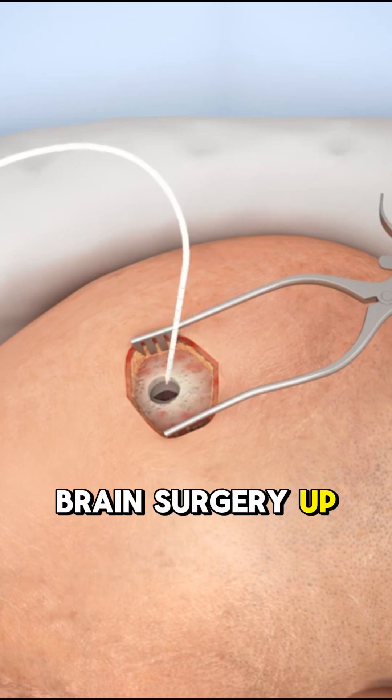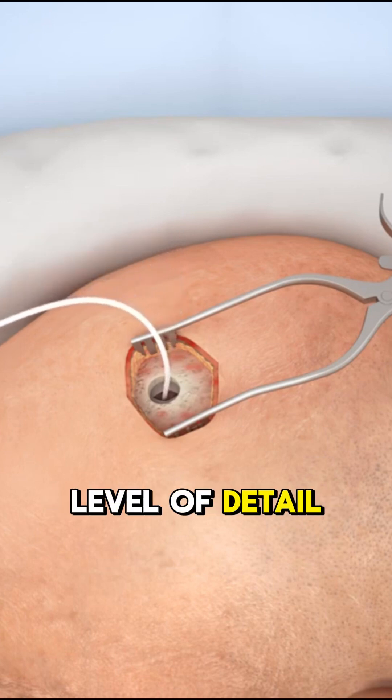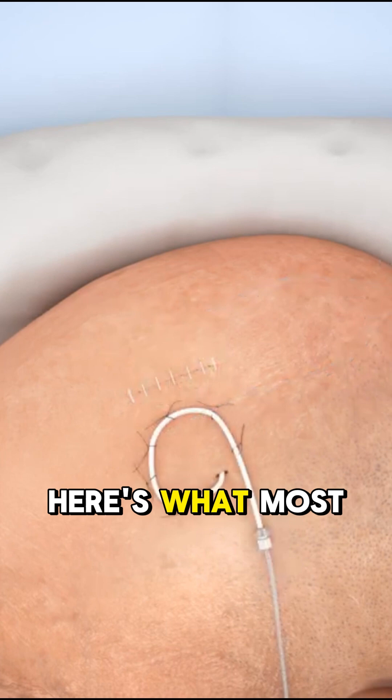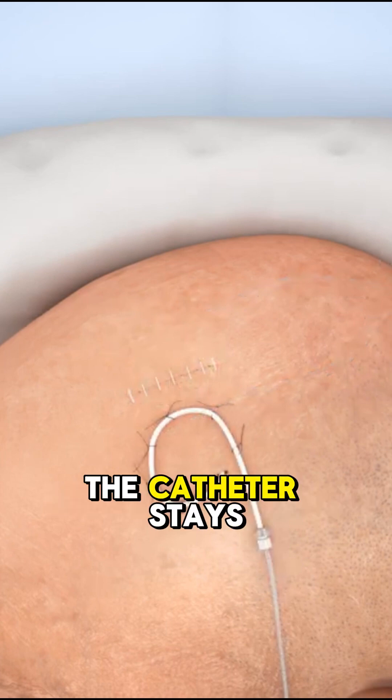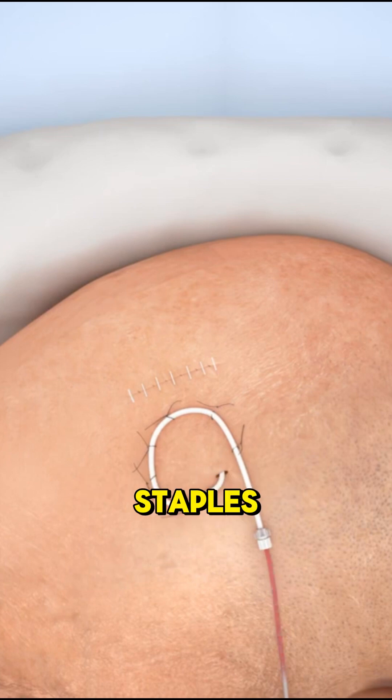Ever seen a brain surgery up close like this? Tag someone who could handle this level of detail. Here's what most people don't know — the catheter stays in. The skull is closed using metal staples, securing the catheter and tubing outside the head.